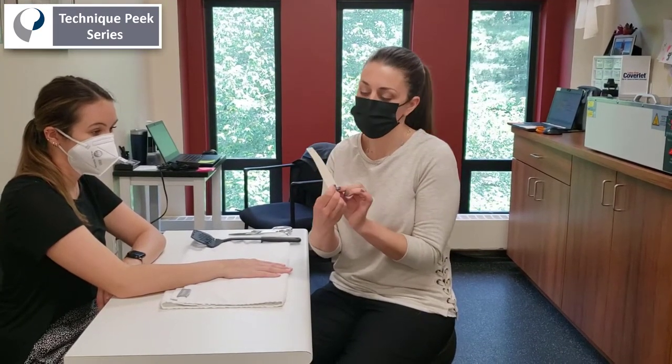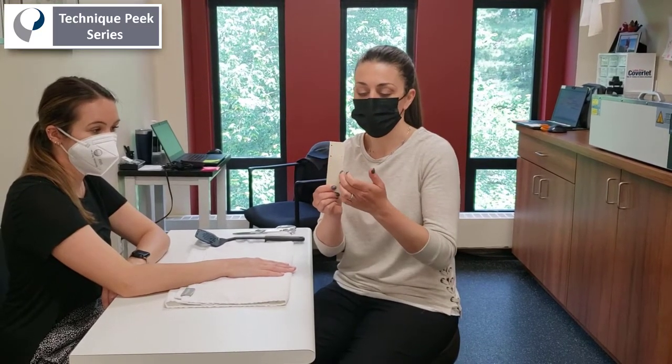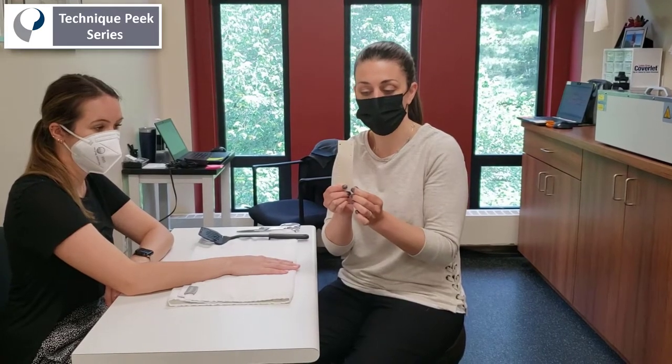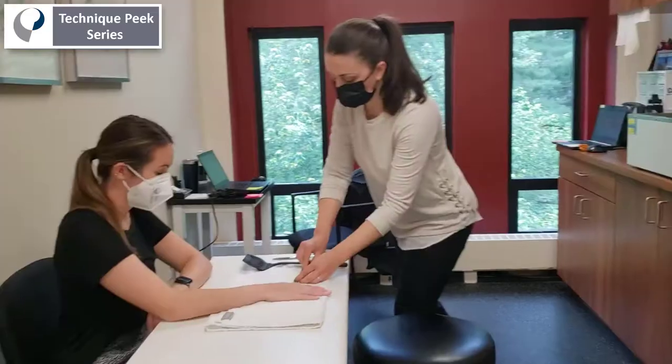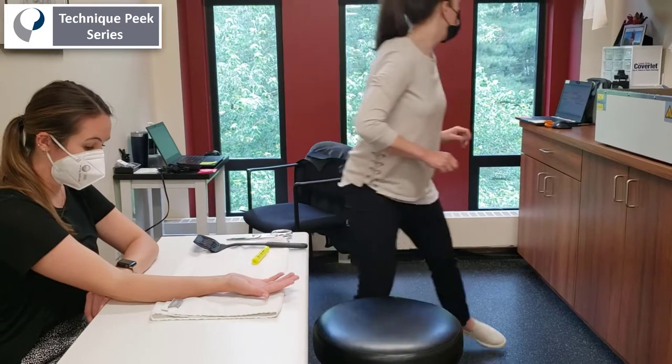You're going to start with a thin strip of material, preferably with perforations, because the holes and perforations can help you cut slits that you will need for the strap part of your splint. Go ahead and warm the material, and while you're doing that you can position your patient palm up so they're ready for the molding.